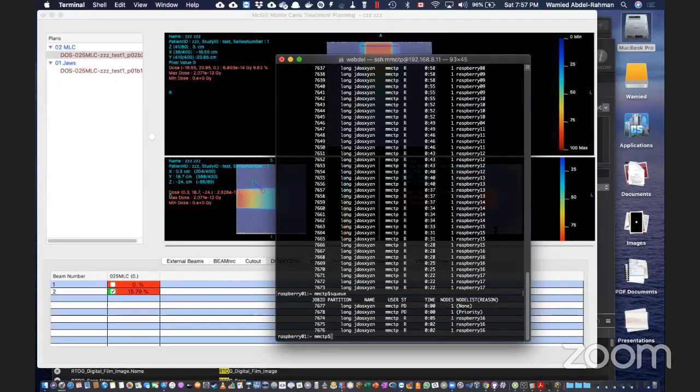To tell you the truth, Andrew, I had multiple problems. One of them is that I could not validate whether I had a phantom or not. I was getting everything black. Now you showed us that when you modify the contrast and the window levels, you will get the phantom. You will get the pixels. So that was one problem.